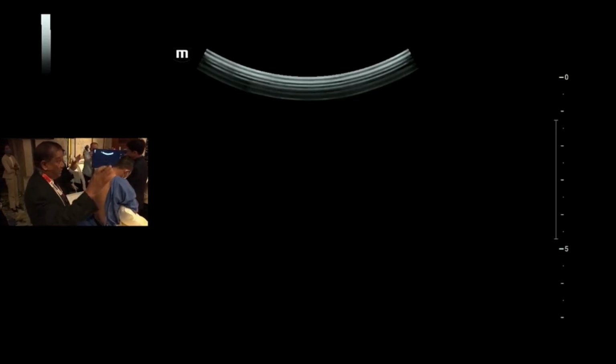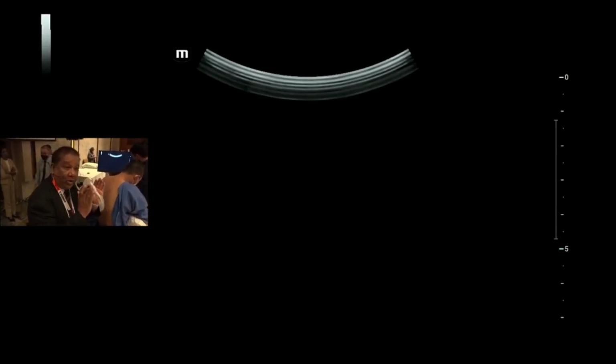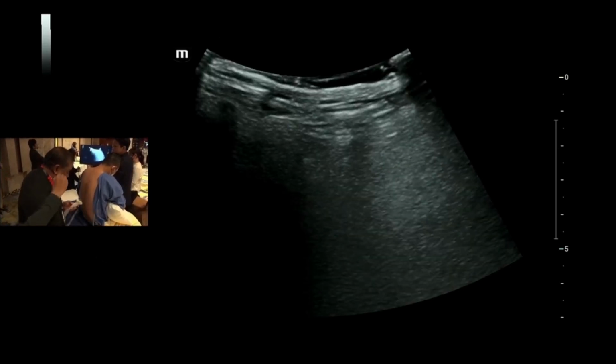Today, with improved ultrasound hardware, software processing, these transducers can produce very, can you reduce the depth over 6 centimeters? Can produce exceptionally good quality images. More importantly, it gives you a very wide field of view. So you get a perspective of the whole anatomy. Where is the medial, where is the lateral, whereas you're not confined to a very narrow window where you're working in a very critical area. So over the years, we have converted ourselves to using the curved linear probe.